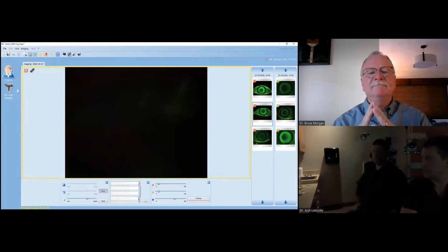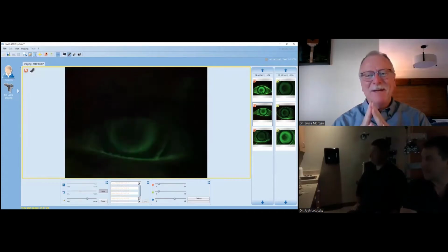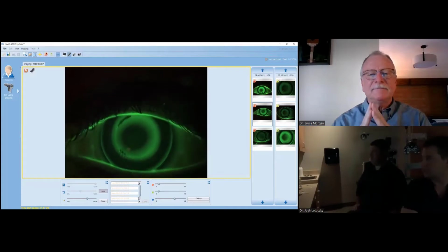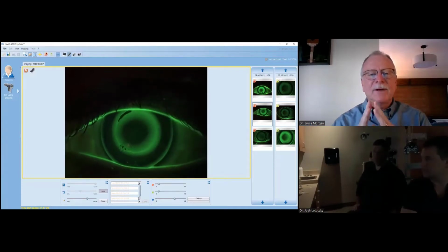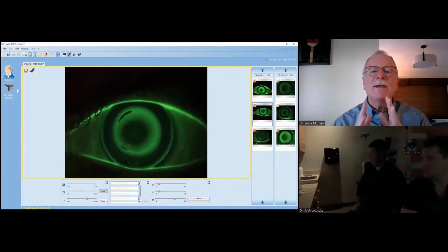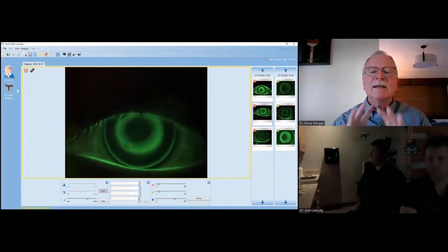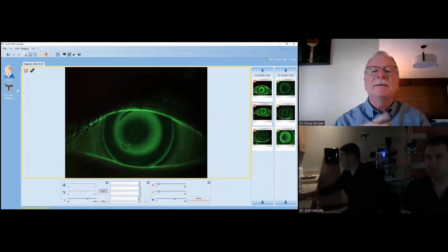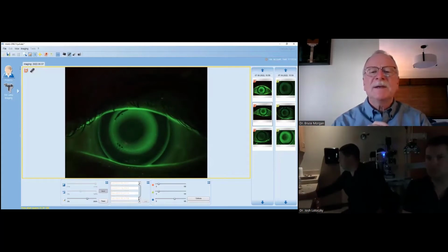Dispense. Exactly. Dispense. Don't go for that textbook. You may be adjusting this after a week or two, but it's definitely dispensable. And if this looks at a 1 week or 2 week visit, you're going to have those topographies to look side by side and say, okay, is this an acceptable fit?